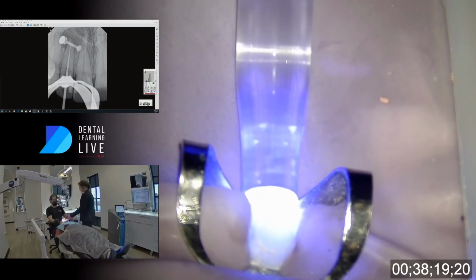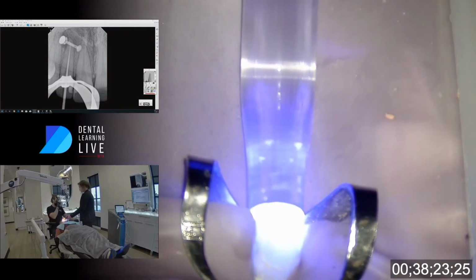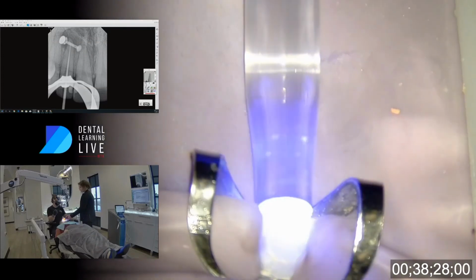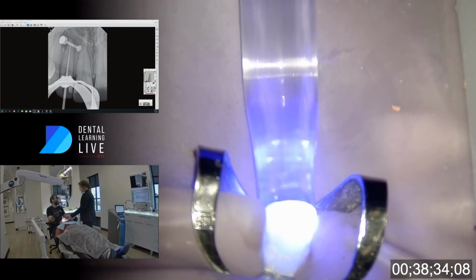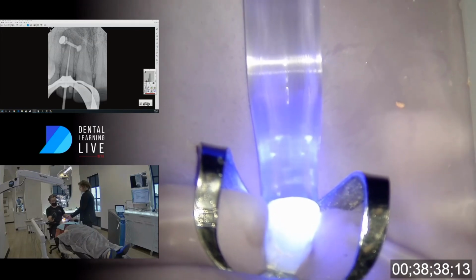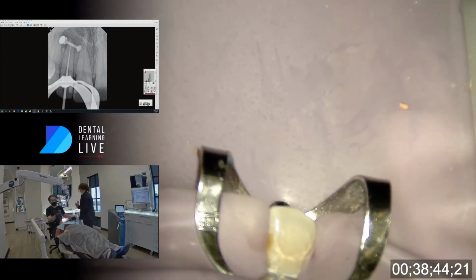One of the debates is, with a lesion of that size and even suppuration, do you just put calcium hydroxide directly in? And I think that's up to every user. For me, I find that this is really efficient, and I have had great success with bone regrowth. So one of the things we can do as time goes on is look at post-operative outcomes, I guess.